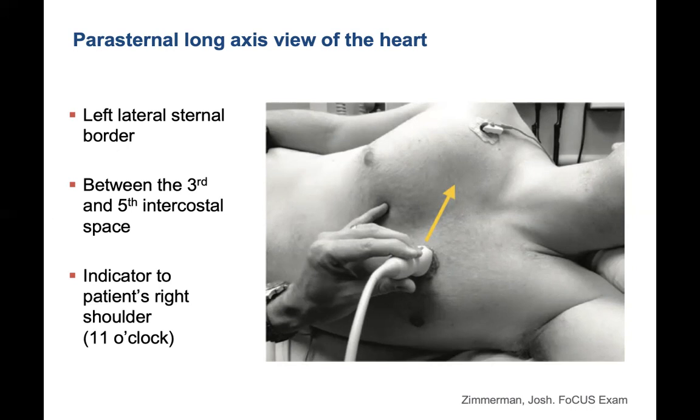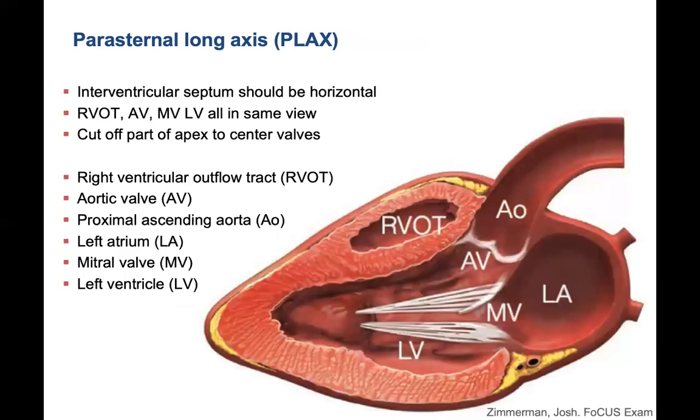Of course, you see this patient is in the left lateral position. That is going to be optimal for getting our exams, but oftentimes that's not feasible. And so I always make you practice with the patient flat on their back, or maybe a tiny bit of a tilt towards the left lateral, but you can always have them turn all the way over to the left lateral if you'd like to really optimize your image, and that's an option.